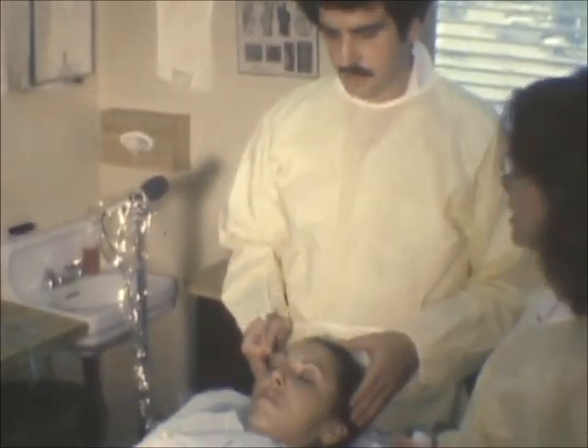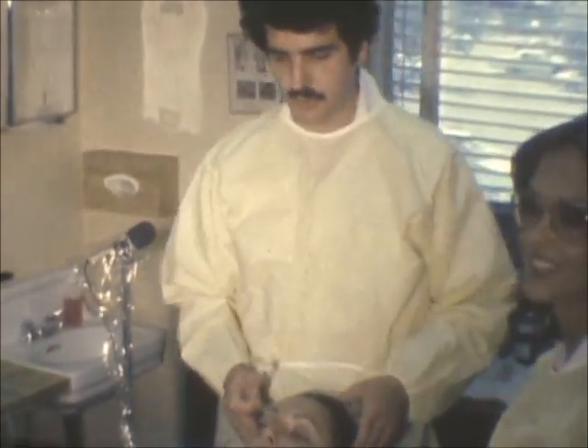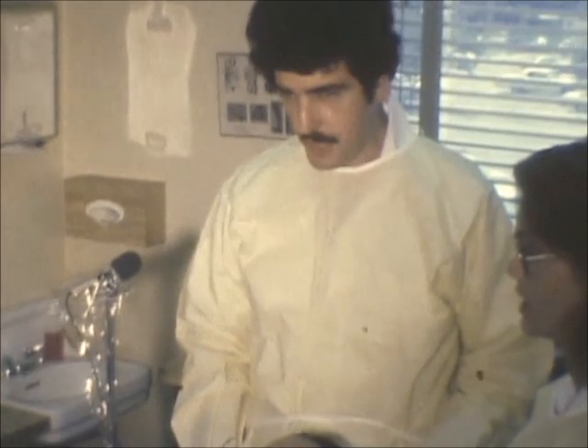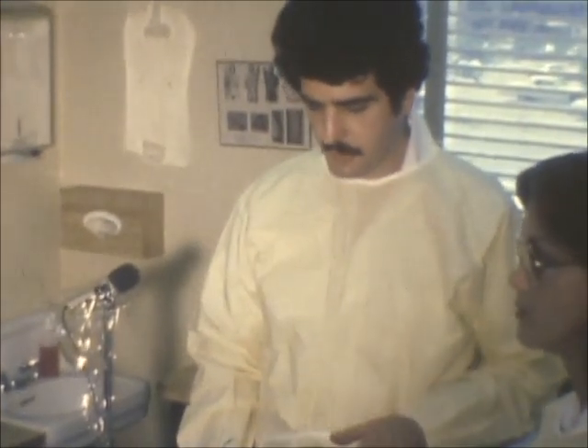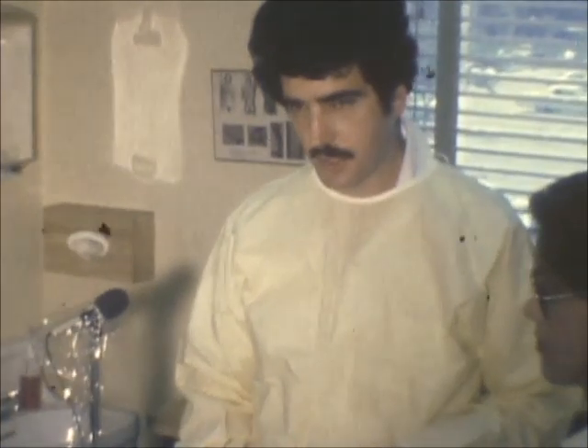Today we're going to do a chemabrasion, which is a chemical peel and dermabrasion. This is mostly for acne scarring and other problems, such as sun damage, wrinkling, freckle-like spots, and sometimes chicken pox.